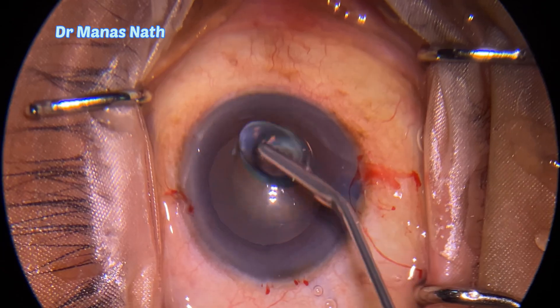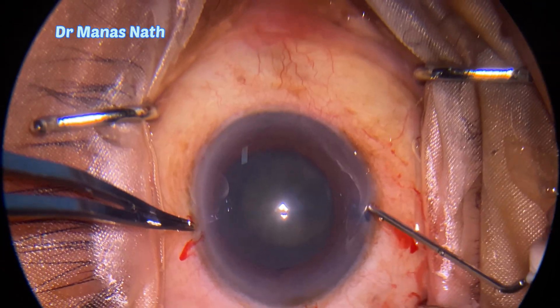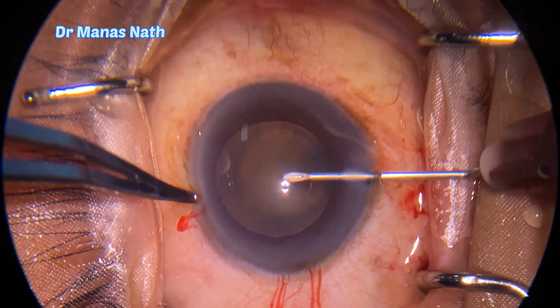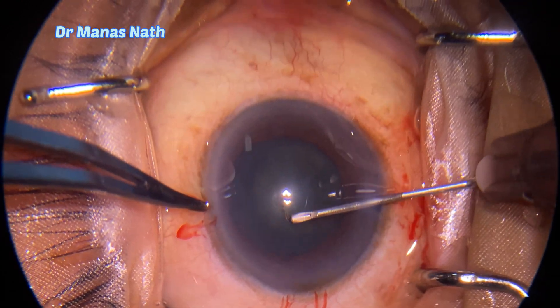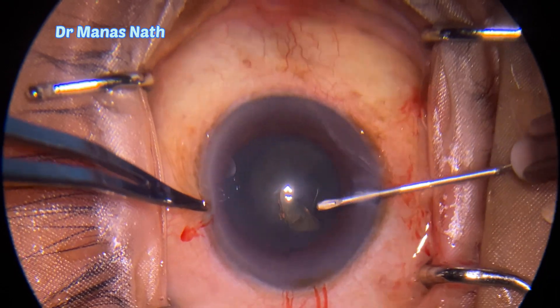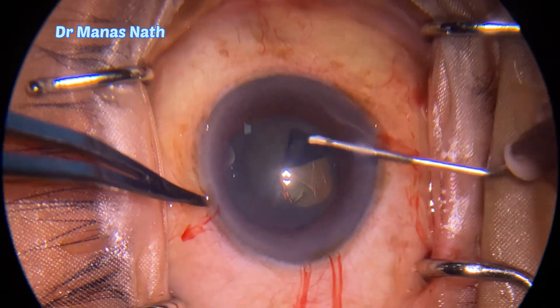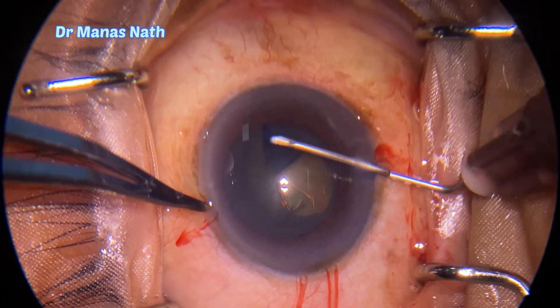Clear corneal tunnel now initiated. Initiating my capsulorhexis with the bent 26-gauge cystotome. The aim is to do a capsulorhexis of between 4.5 to 5 mm.